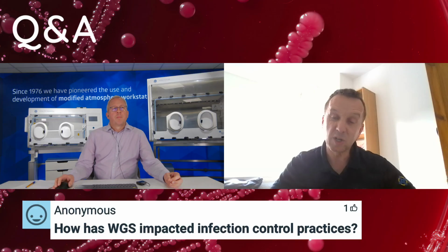The easiest one to start with there, I guess, is with Clostridioides difficile. So this has had a huge impact in terms of IP&C practices in terms of managing C. diff outbreaks. We've had whole genome sequencing SNP analysis available to practitioners within IP&C in Wales for 3 or 4 years now. And the way that we run that service means that they can impact on outbreaks and manage them much more effectively in much closer to real time.